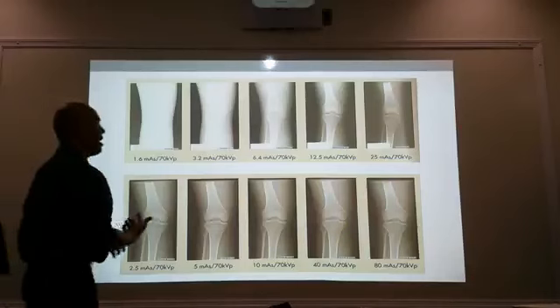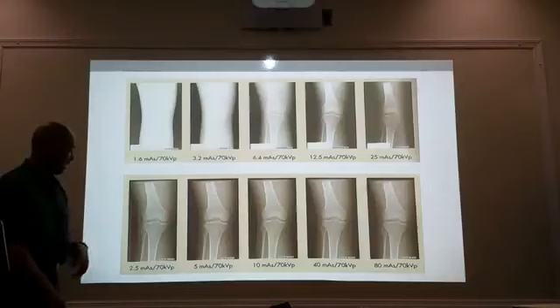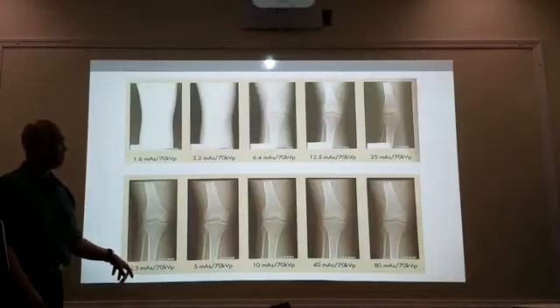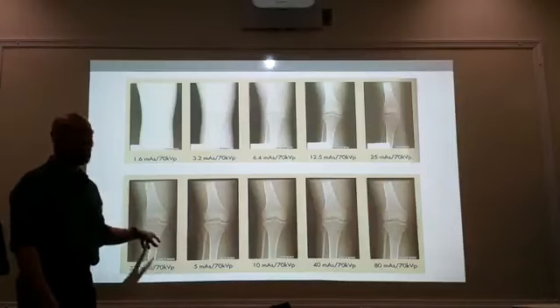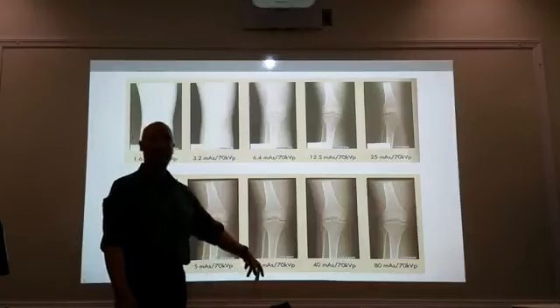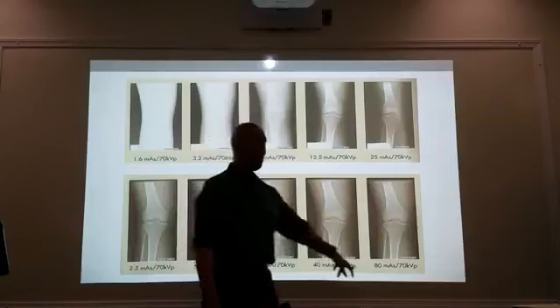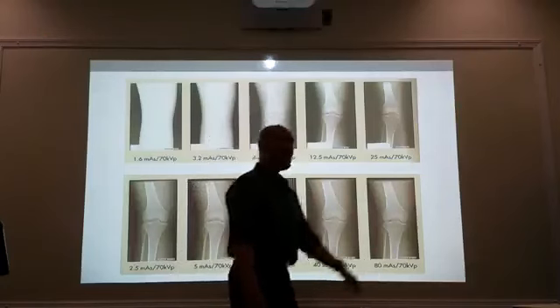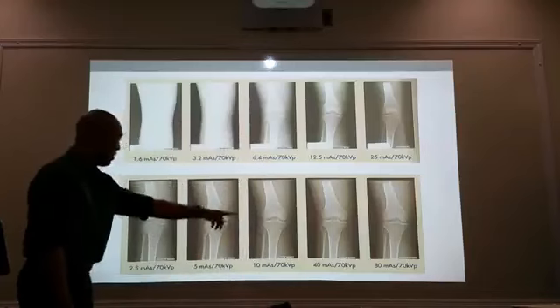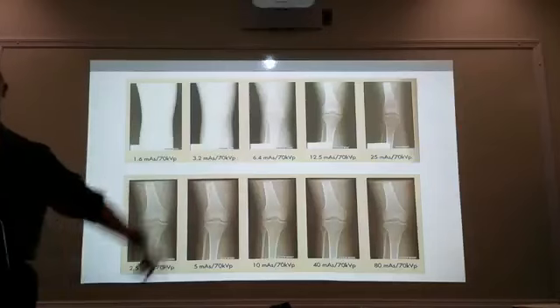Here is computerized radiography. Same study with computerized radiography. Here's 2.5 mAs. Looks good, doesn't it? We doubled it to 5. Looks the same, doesn't it? We doubled 5 into 10 mAs. 40 mAs, and then, oh boy, 80 mAs. That's a lot of X-rays. So we went from 2.5 to 80. This is almost 35 times the patient exposure.